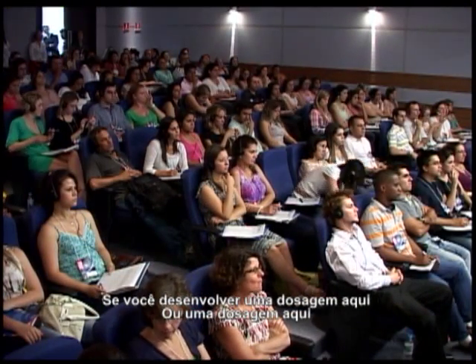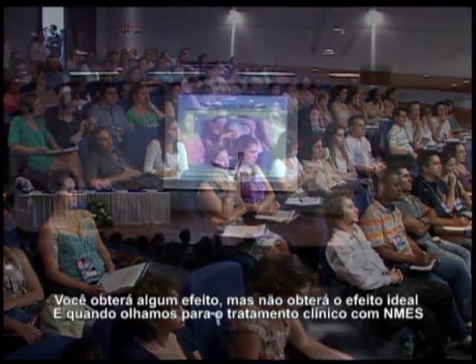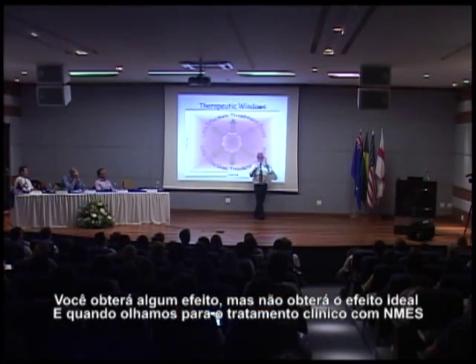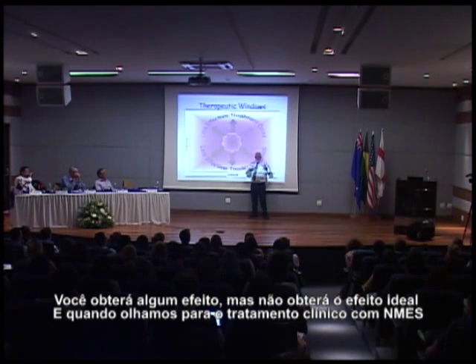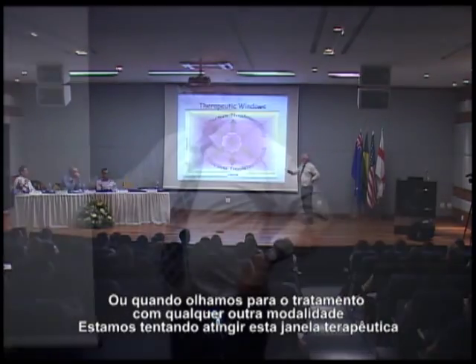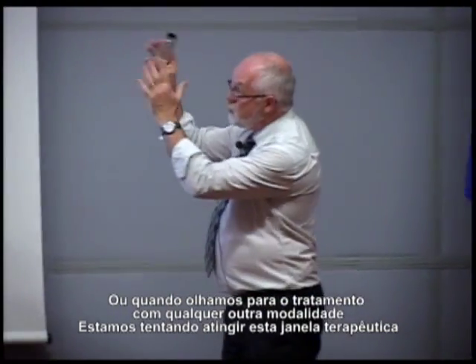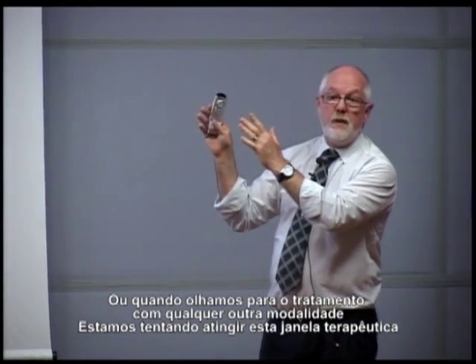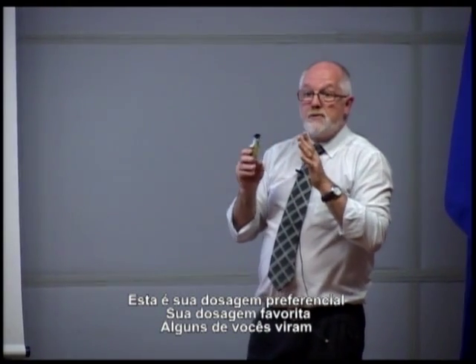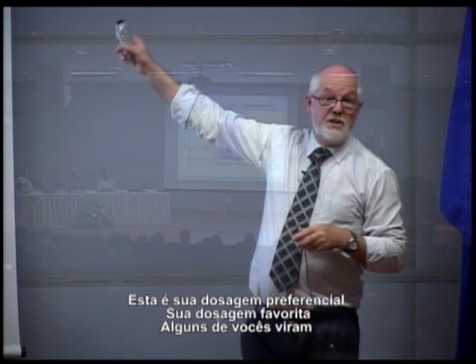And if you deliver the optimum dose, you get the optimum effect. If you deliver a dose over here or a dose over here, you will have some effect, but you will not have the optimum effect. And when we look at clinical treatment with NMES, or any other modality, we are trying to hit our therapy window. That's your preferential dose, your preferred dose. Some of you will have seen this.